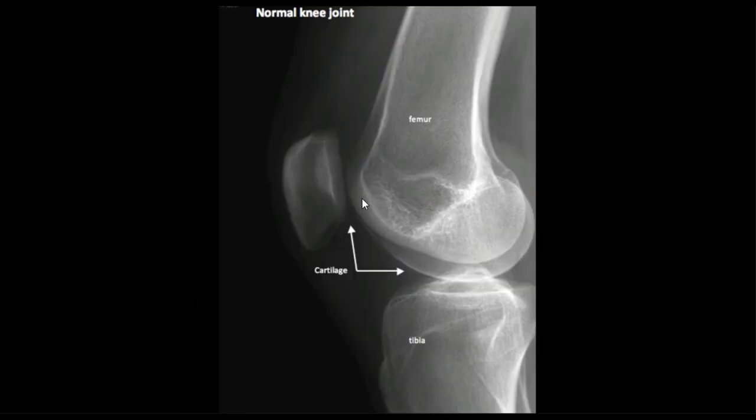Alright, I'm sure everybody's mastered finding the lateral notch by now, so much so that whenever the image pops up your eye is instantly drawn to it. Now we're going to do a bonus round — three seconds on the clock. Try and find that lateral notch as fast as you can. Here we go. Did you guess the image was too medially rotated? A little bit of cephalic angle would probably help out too. No help from the adductor tubercle, but the fibula is projected pretty far forward onto the tibia. Most important of all, the lateral notch is clear as day. Lateral side — flat; medial side — round. Good job, guys.